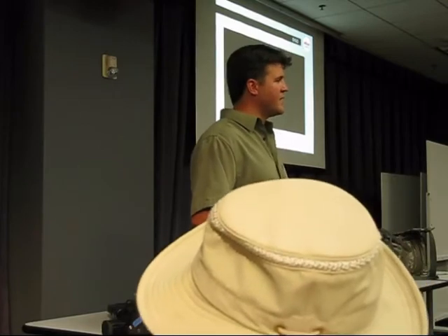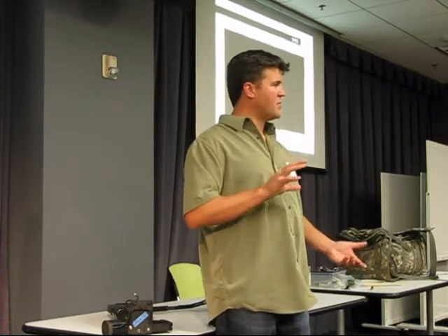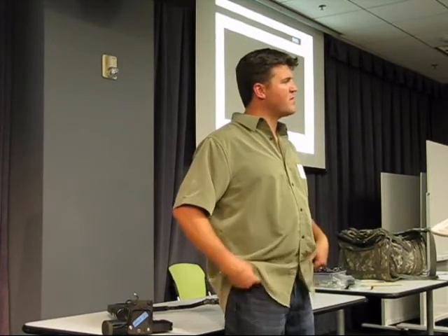And the real crux of the issue, it's not the foot thickness, it's the fact that we're not powering the ankle. So if you look at the joint torques on normal human walking, most of your forward propulsion comes from your ankle. So right at toe off, that's why your calf muscles are so big. They're actually pushing you off at toe off, and that's where most of your propulsion force comes from. We don't have active ankles on the exo because we don't want to pay the inertial penalty to swing that inertia down at the ankle. So we actually input most of your walking torque at your hips. So I think that causes most of what we call the exo gait. So it's more of a straight legged gait than you would do without the exo.